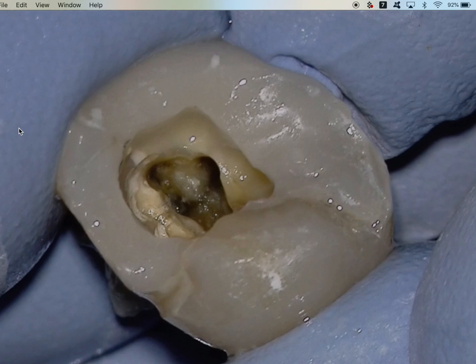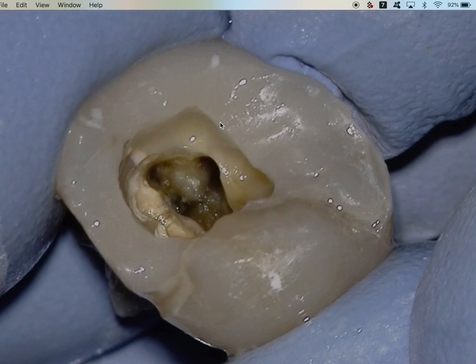Using a couple of different tips and tools that you probably have in your clinic today, so you can find them for tomorrow. We have an extracted tooth and three clinical cases, and by seeing how different MB2s are placed — this is a very simple one — this is MB1, this is MB2, there's a distal buccal, and we removed a lot of the restoration to get better visualization. There's actually a crack running here. We're taking a look at different accesses; we're not going to complete the whole root canal, just getting into the teeth.